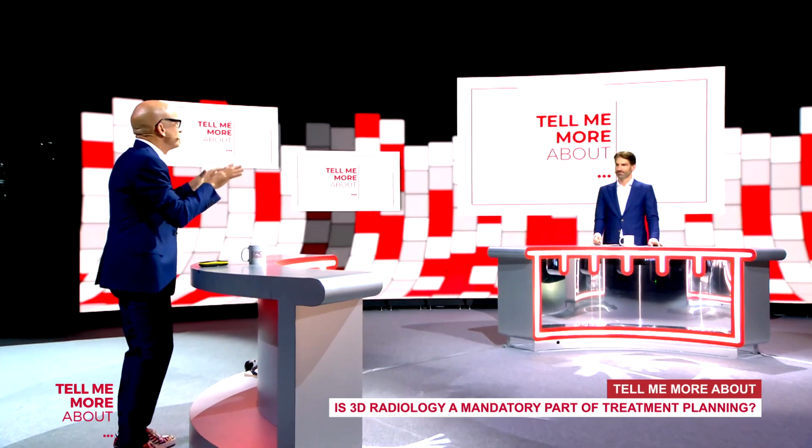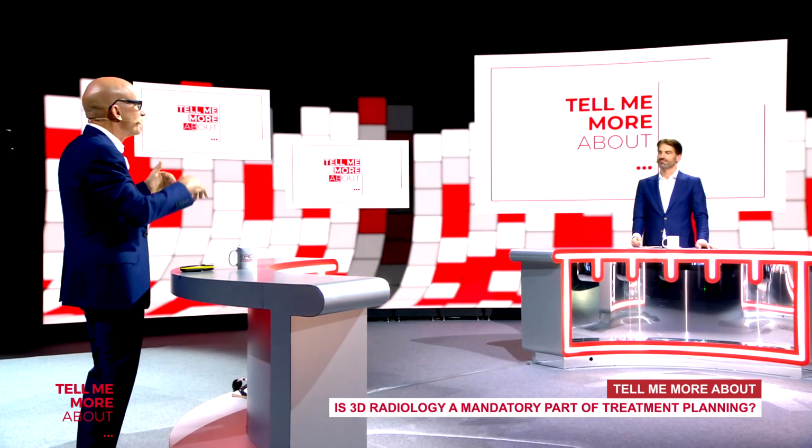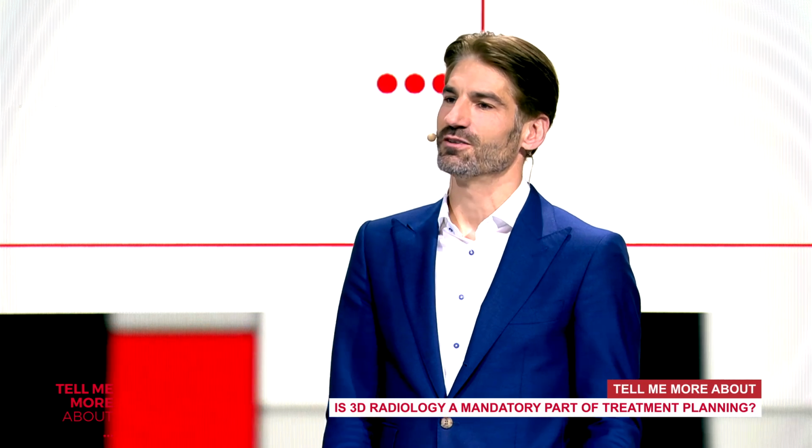Why, Markus? Why did you decide to start working like that? You know, over the nerve, you always find cortical bone, always. There is always a very dense bone. And you can start to see these things as an experienced person. It's nothing for a beginner, I agree. A beginner should be careful to place an implant as close as possible to the nerve. Don't do that. Then go another way or have the bone augmented or something like this. But the more experience you get, then you can do that. You start to feel the bone, smell the bone, and see the bone. And this is important. And this is something that definitely comes with experience. Yes, of course. This is experience.